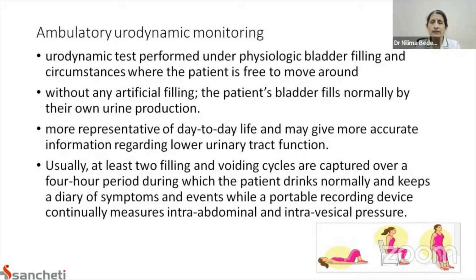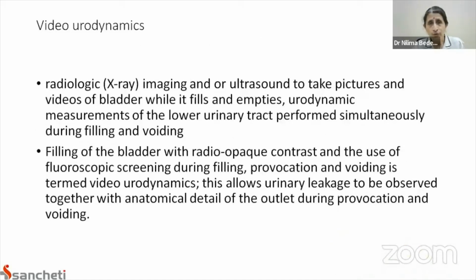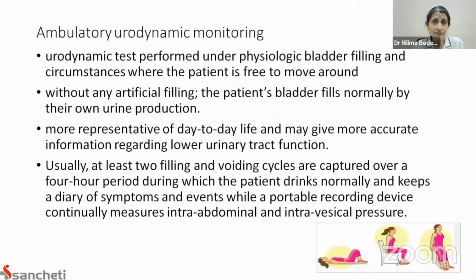But still it is under investigation and needs to go into further detail to see whether it is more appropriate than doing only video urodynamics or cystometric studies. Again, this needs a lot of precision in putting in the catheters, and the person is moving around with all this. So this ambulatory urodynamic monitoring is still under review. But it can be the next level, a more natural setting, and it can determine a lot of other problems of the lower urinary tract.